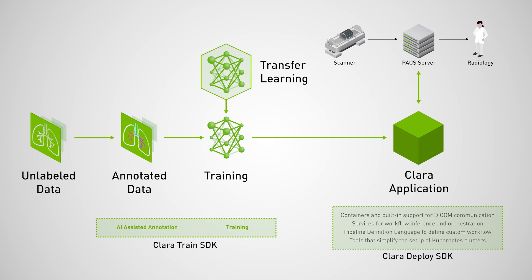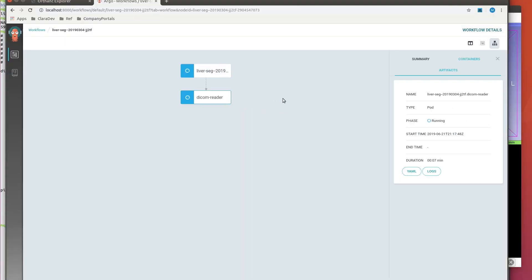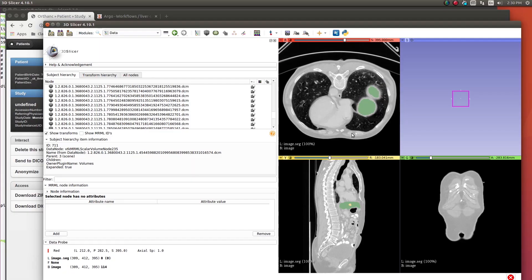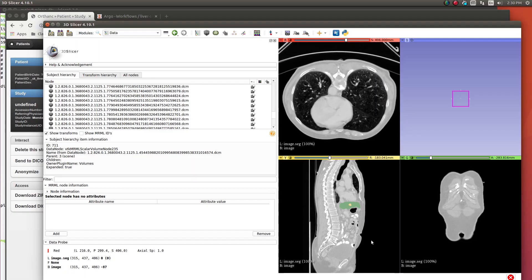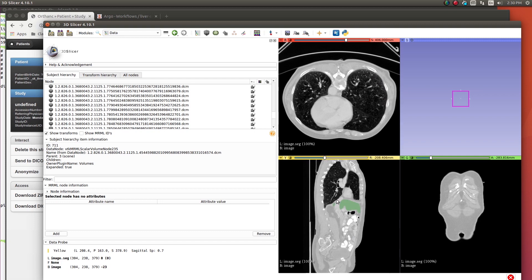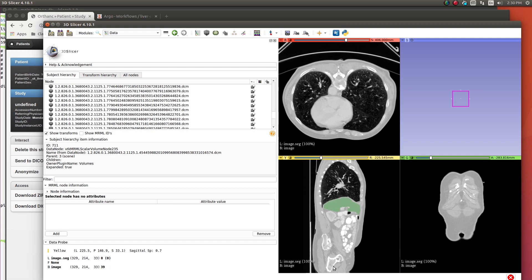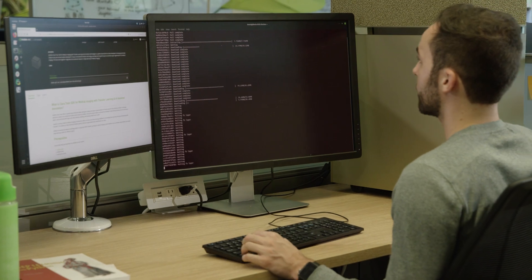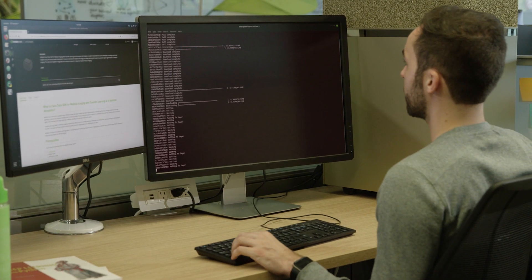You can monitor the processing of different stages of the pipeline using the Argo dashboard. Using any standard medical viewer that can read DICOM, you can visualize the AI inference results. And this is how you can take your AI algorithms into the radiologist's world.